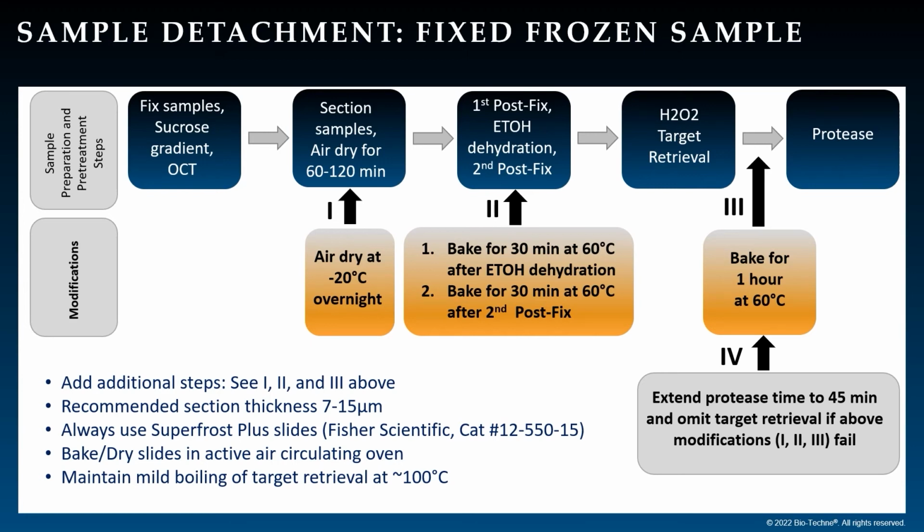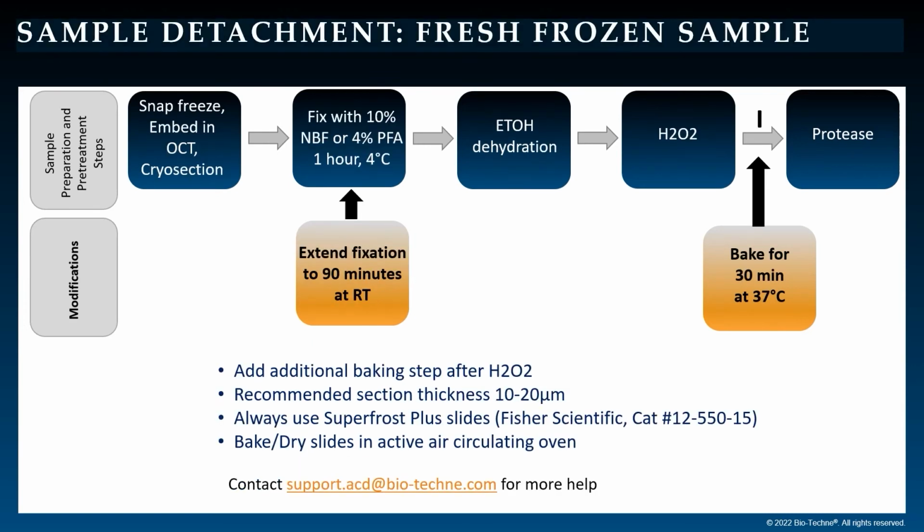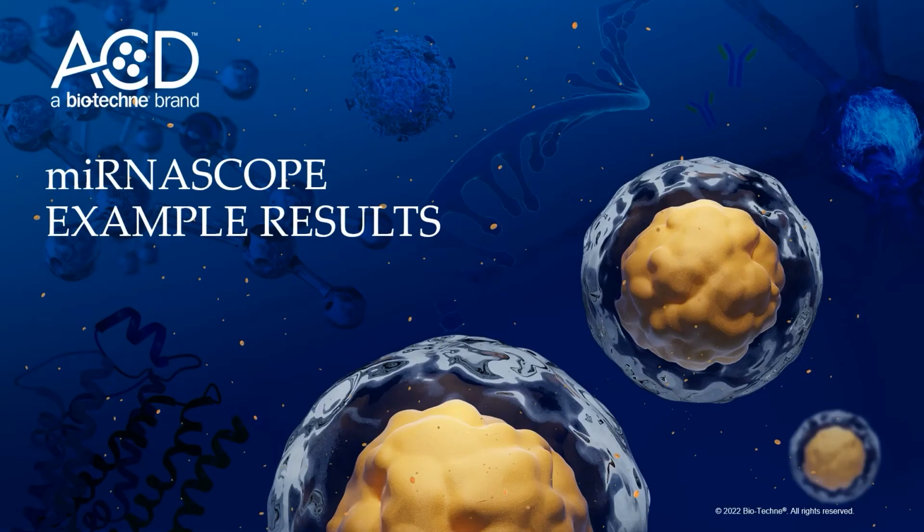After trying steps 1 through 3, if you continue to observe tissue detachment, then we recommend that you extend the protease time to 45 minutes and omit target retrieval. For sample detachment issues with fresh frozen tissues, we recommend extending the post-fix duration to 90 minutes at room temperature and including a baking step at 37 degrees Celsius for 30 minutes. If you continue to experience issues with detachment or other issues as mentioned earlier, please contact technical support for additional guidance. Many of our users have had success with the miRNAscope assay.